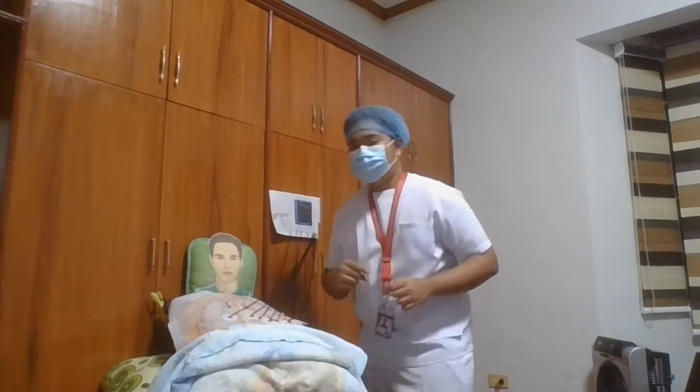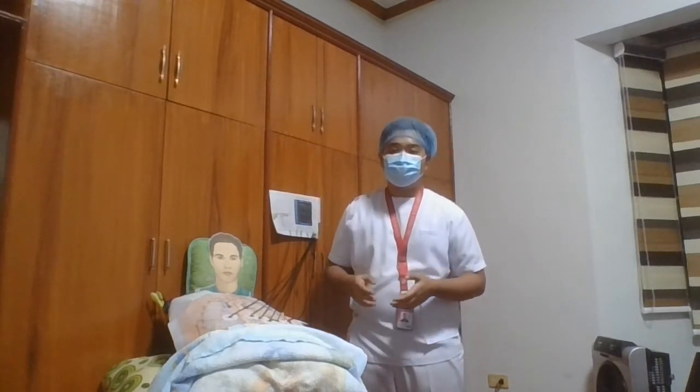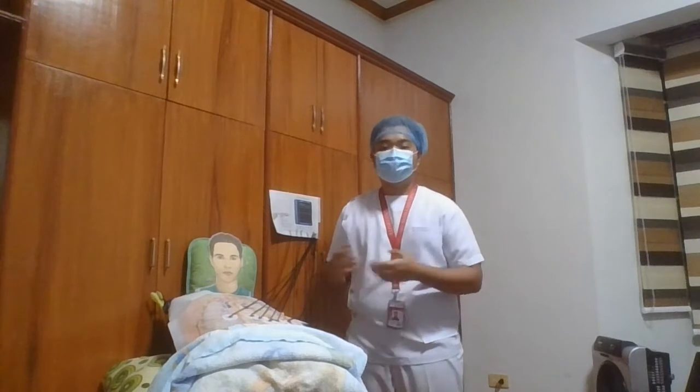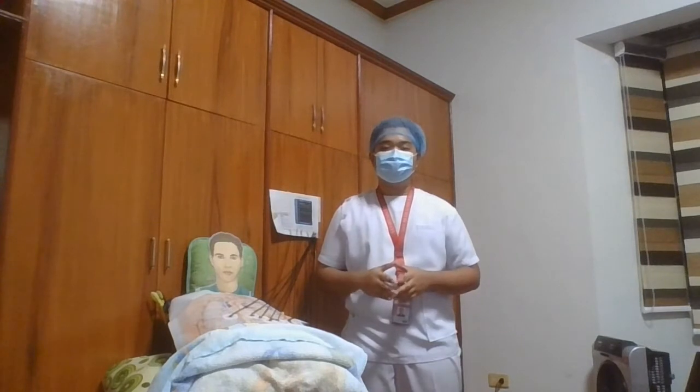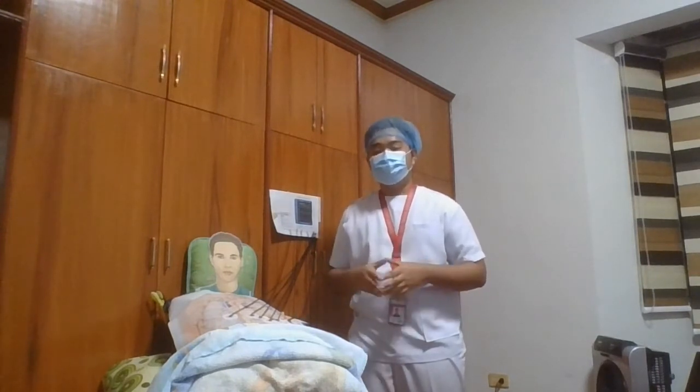And then afterwards, we're going to connect the cables to the EKG machine and attach the cables to the appropriate electrodes, which we have prepared already. And then now we're going to instruct the patient to relax his shoulders and legs while recording. We also need to remind him to remain still during the recording because muscle movement or tension causes an artifact. And then now we're going to activate the machine to begin the EKG.